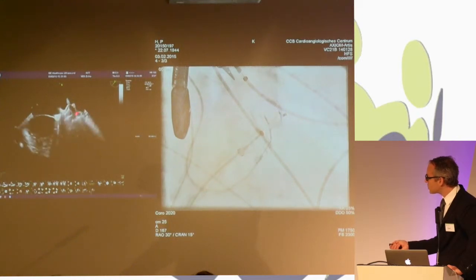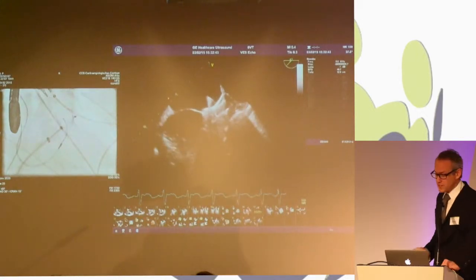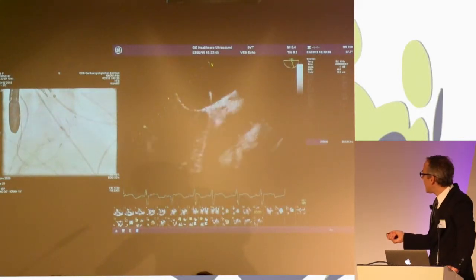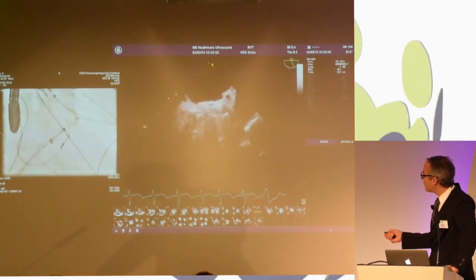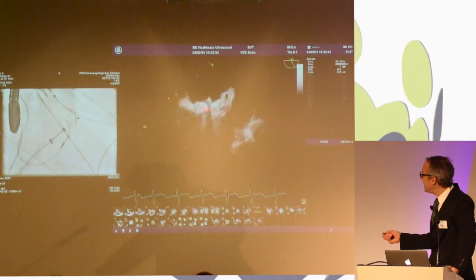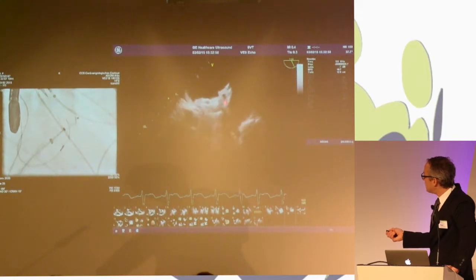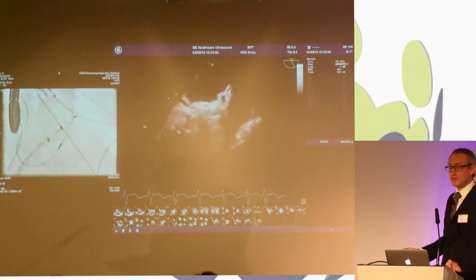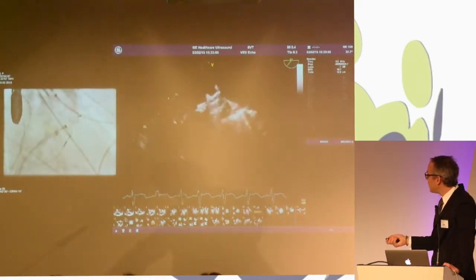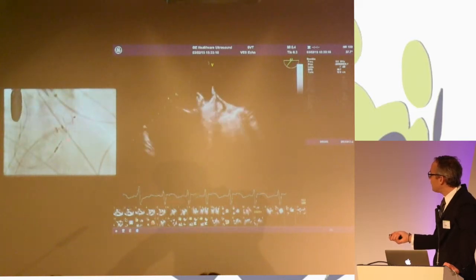We're measuring the compression. It's 19. So the 25 millimeter lobe is compressed to 19 millimeters. And again, we're looking at it in different angulations. This is the 100 view now. You see it's now completely plugged into the left atrial appendage. There's no more shoulder. You see the additional lobe here, which is a retroverted lobe of the distal lobe of the left atrial appendage. And usually we're shooting angiograms at this point in time.